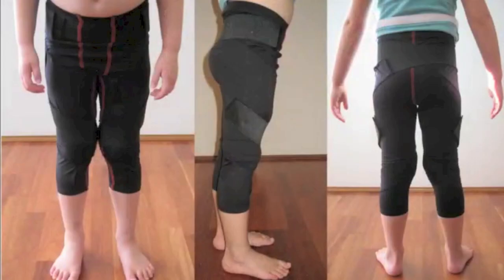This is a spiral thigh brace for Straps Australia. This is an image of the spiral thigh brace.